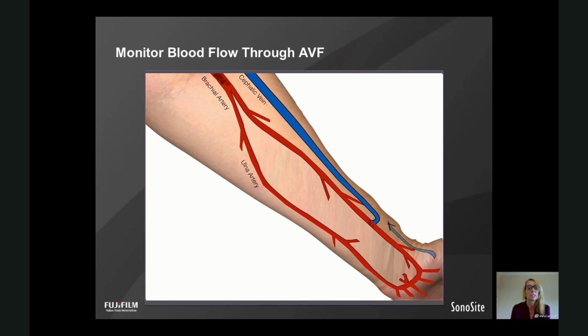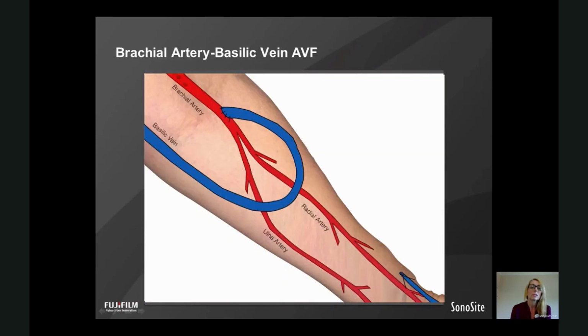And so when we check the flow of blood through a fistula, what we're doing is checking if there's an issue with either the pump, the heart, the arteries, or the outflow veins. So the volume flow measurement doesn't particularly identify where the issue is, but it does tell us if there's an issue. Once we've anastomosed, if we have a good pump, the heart, a good artery, and a good draining vein, we see that the flow increases dramatically in that circuit.